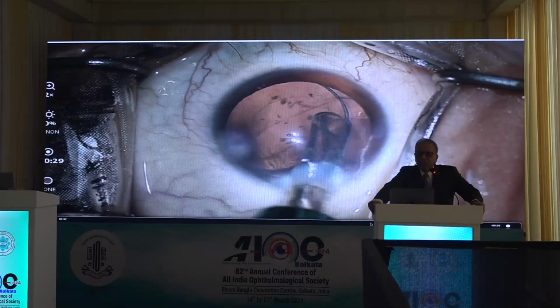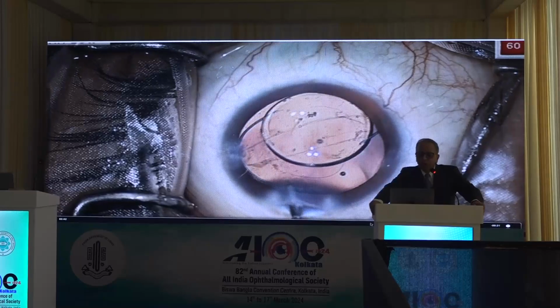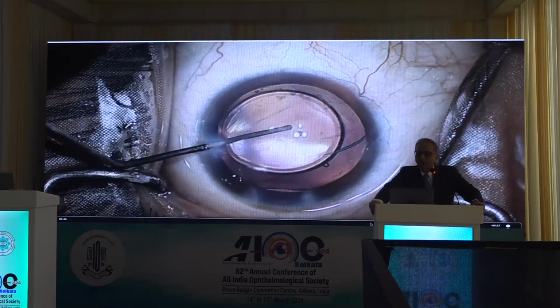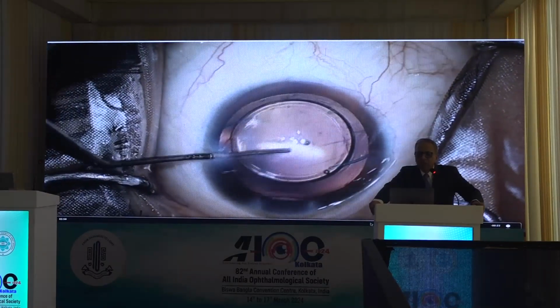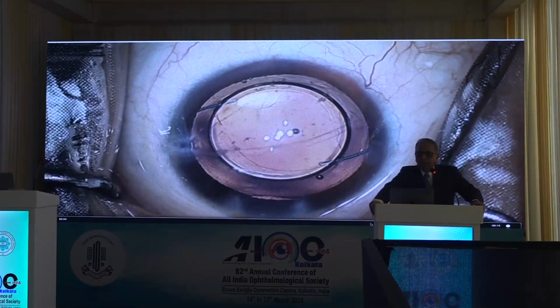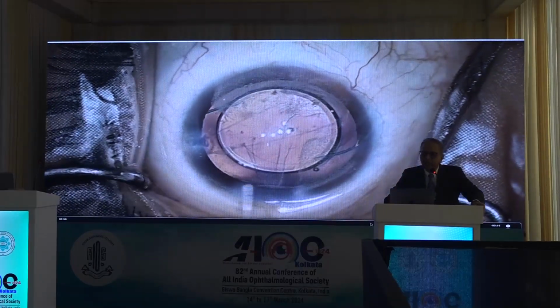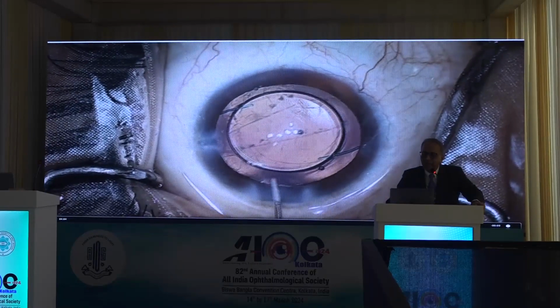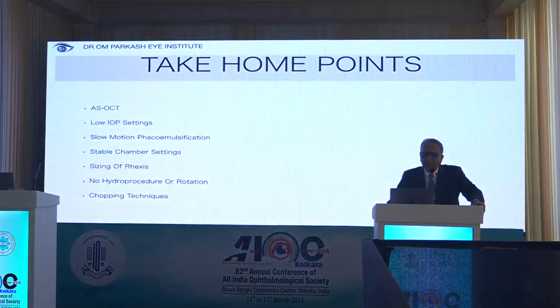I am using a 3-piece intraocular lens in this situation, and I'm going to do the optic capture using the smaller rim of the oval rexis, and you will find that it is complete, spindle shaped as Dr. Saurav has shown. Triamcinolone again, and you can find now that the case has been adequately completed. This is the post-op day 1, and the patient was very happy.